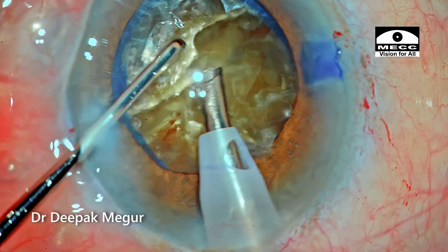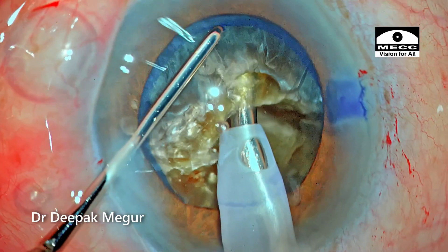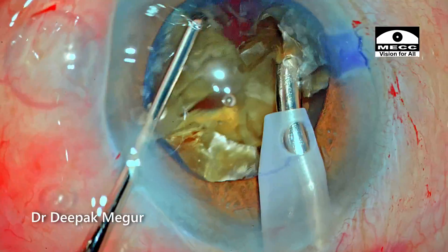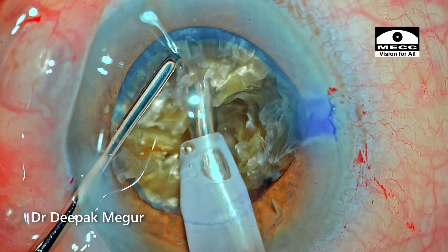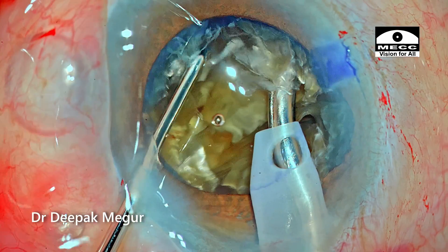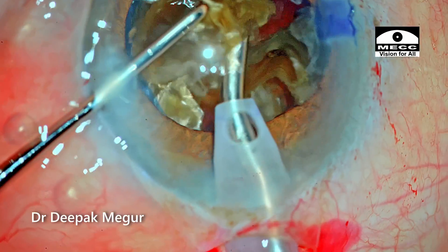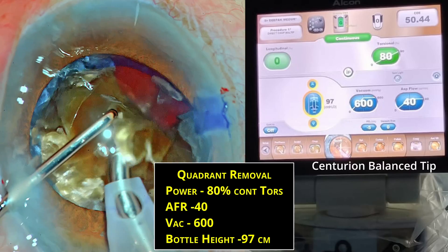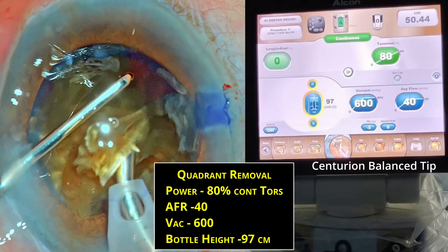Similar division methods are employed on the second hemi-nucleus. The tip is buried deep into the substance of the nucleus, the chopper goes down, and lateral separation maneuvers are performed. Three fragments are created in the second hemi-nucleus as well. Time to deal with each of these fragments — the first fragment is pulled out of the bag and emulsification begins. Settings are changed here; the main change is switching to purely torsional energy with the IP-on setting.